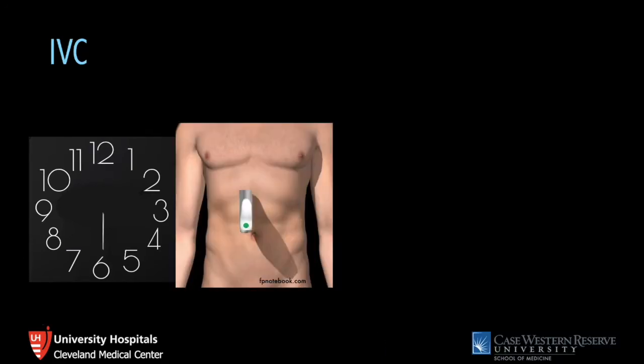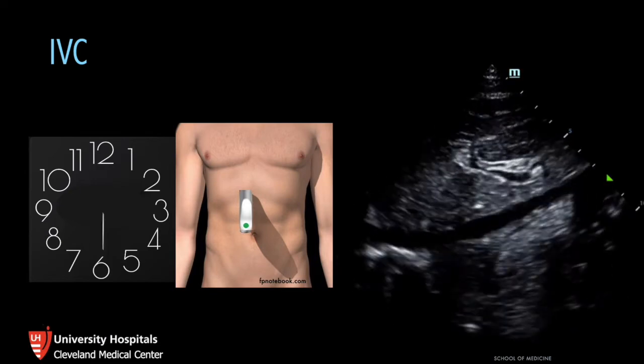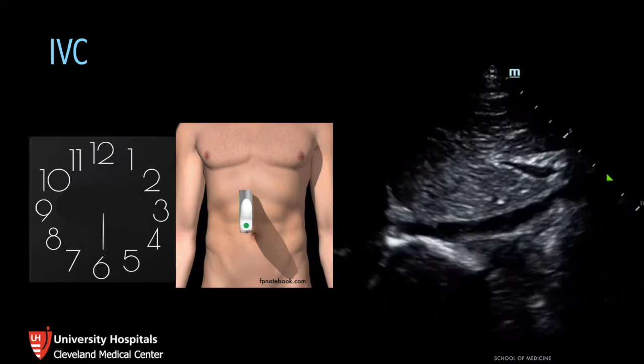The IVC is a great adjunct to your cardiac views. You can have your probe marker pointing toward the 12 o'clock position or the 6 o'clock position. I generally recommend the 6 o'clock position to keep a clockwise movement of the probe marker. You'll have the right atrium on the left side of the screen, the IVC coming in and dumping into it, the liver in the near field, and the hepatic vasculature draining into the IVC.